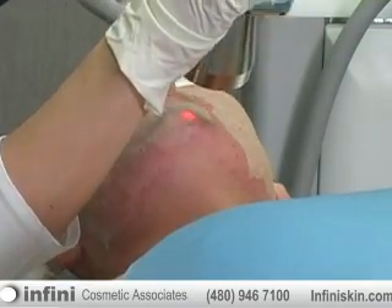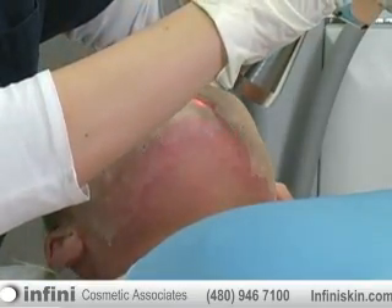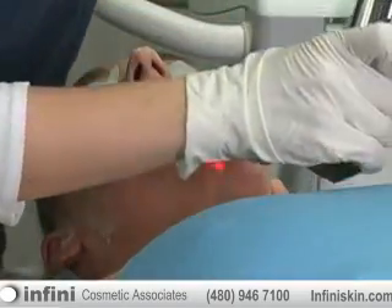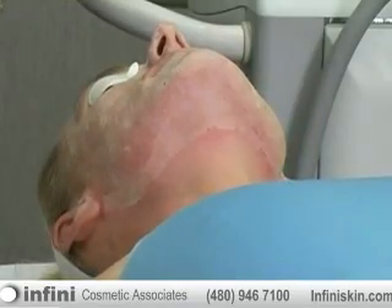Here you can see we're blending in the resurfacing down to just underneath the jaw line, so that there are no demarcation lines seen during the procedure. I think that's a very key element of resurfacing — to go below the jaw line when you're doing resurfacing.